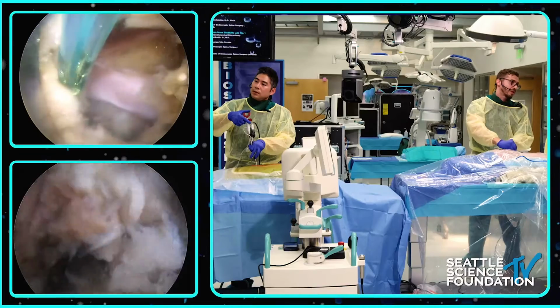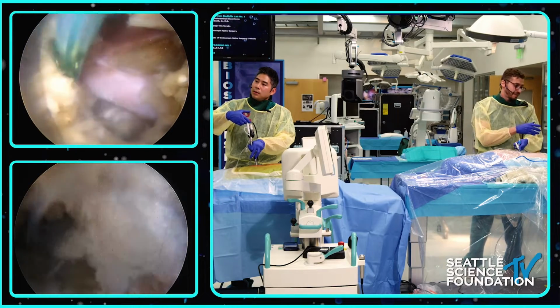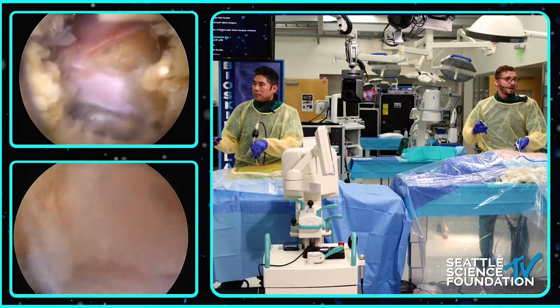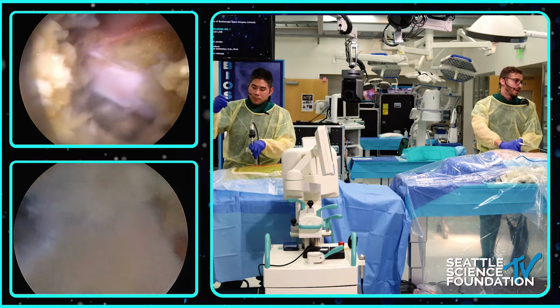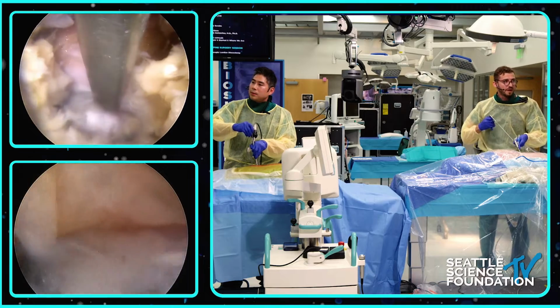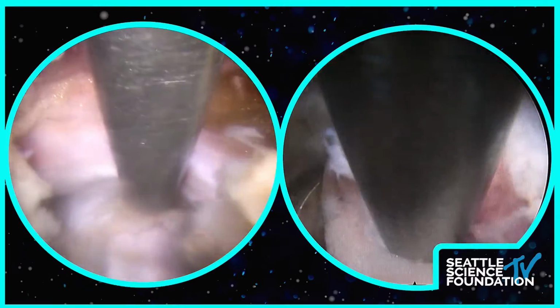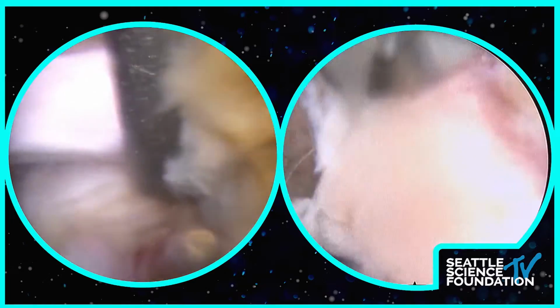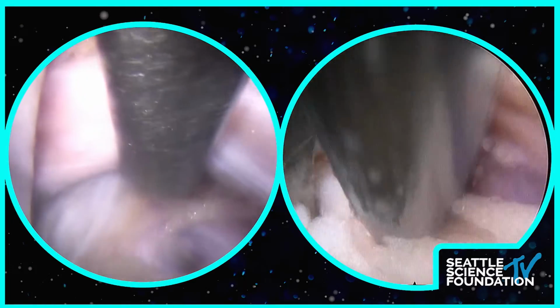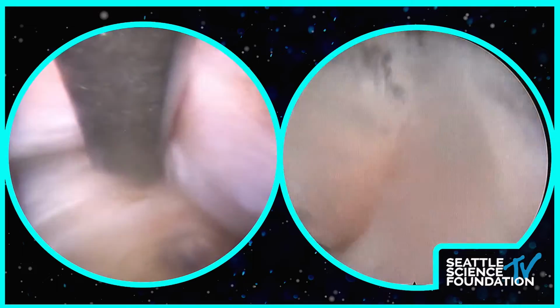So I think this brings up a great point. It's very easy to see what John's showing, right? But I think for a lot of people who are trying to learn endoscopic spine surgery, it's very difficult to conceptualize what you're looking at. Absolutely. I think transforaminal is harder conceptually, but easier technically, and vice versa. Interlaminar is harder technically, but easier conceptually. Do you guys agree? Absolutely. Yeah, absolutely.